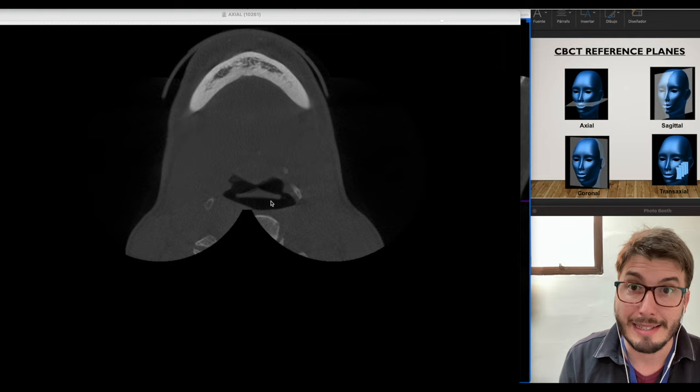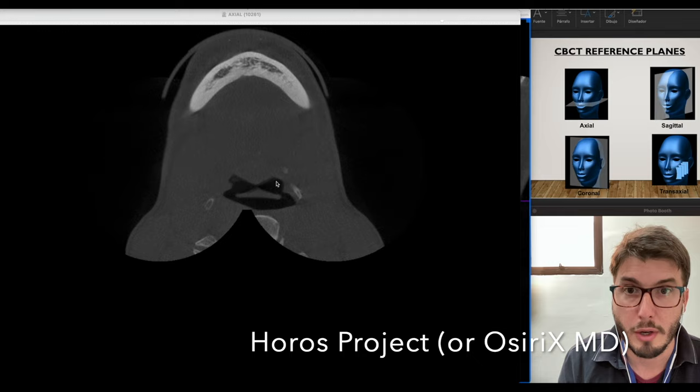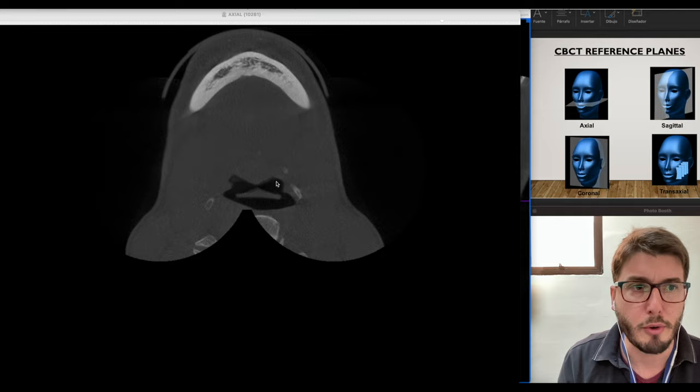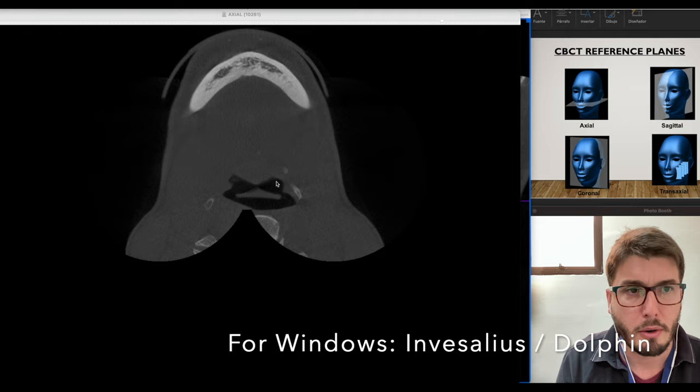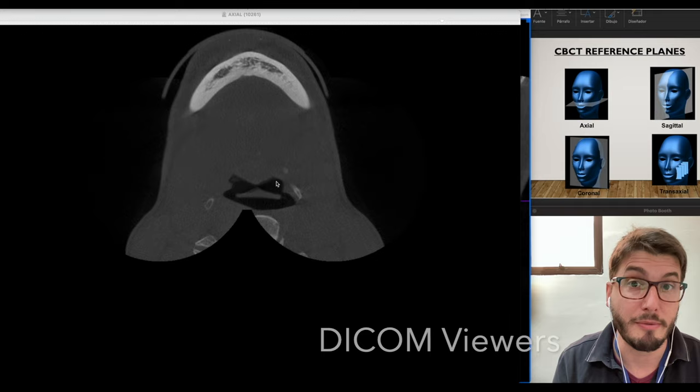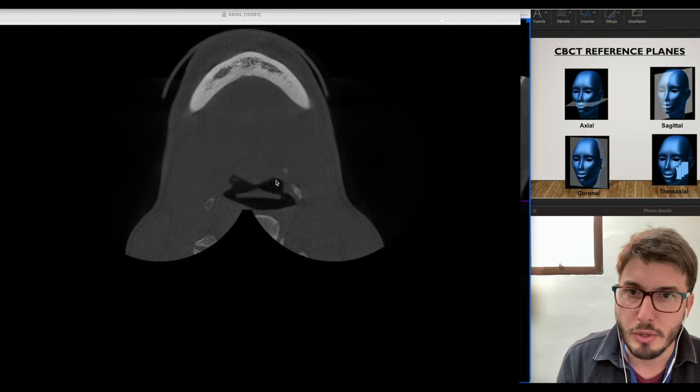I am using Horus software for Apple computers, Mac OS. For Windows computers, you could use InVesalius, the Brazilian software, or Dolphin — there are other DICOM viewers for Windows as well. Here I have Horus and OsiriX MD, the Apple softwares.